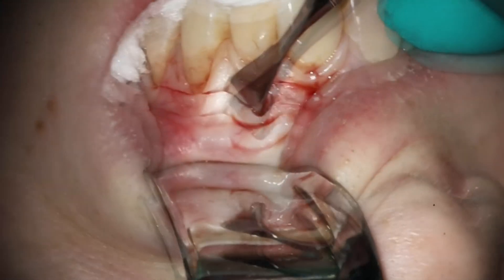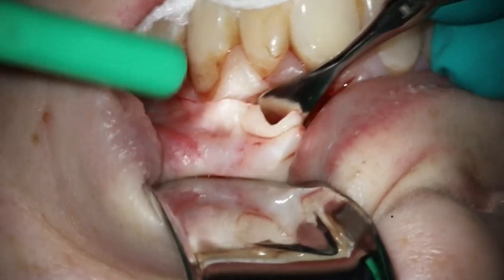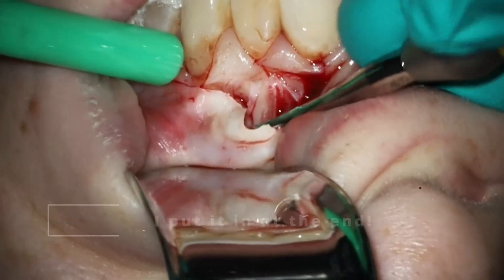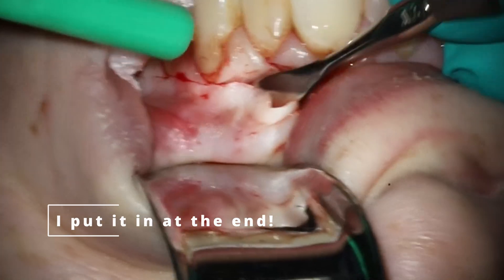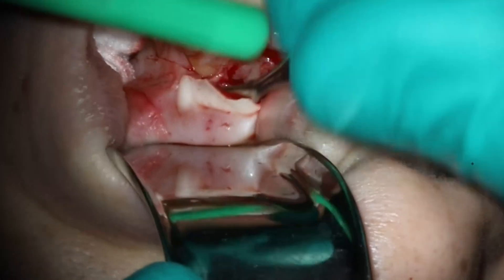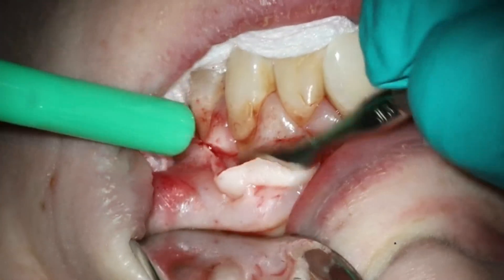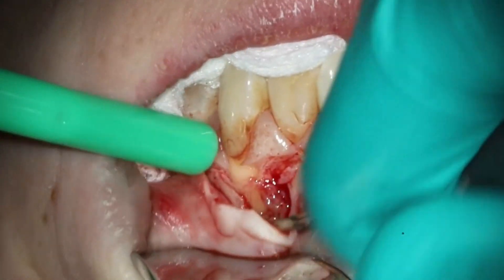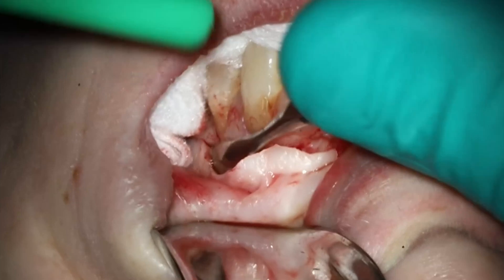That made me uneasy — that feeling in the pit of my stomach. I was already planning on grafting this case. I don't normally graft my surgery cases, but the cone beam — I actually forgot to put it in here, maybe I'll add that in after — the cone beam will show that the defect went all the way through to the palatal tissue. When that happens you worry about invasion of the soft tissue and incomplete healing. I did talk with her beforehand about the pros and cons and elected to go ahead and do a grafting procedure.